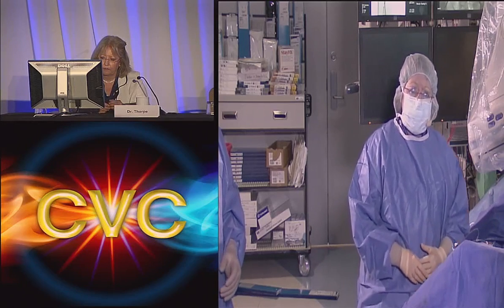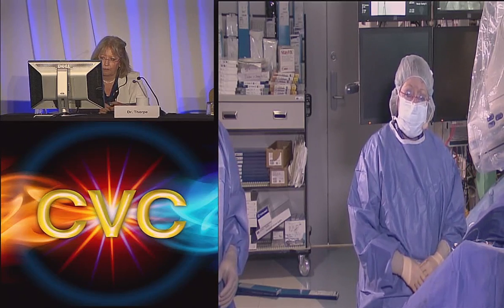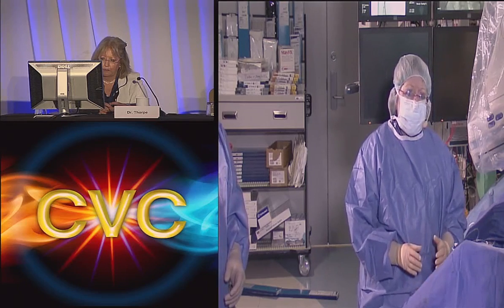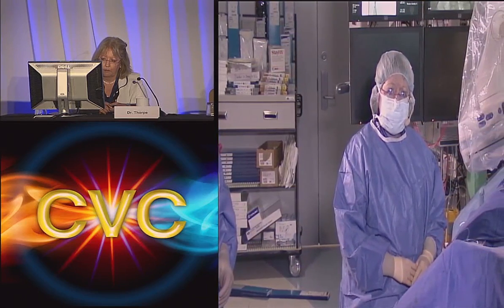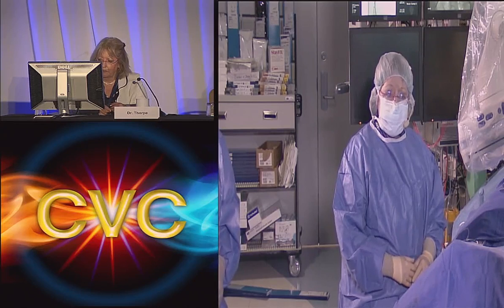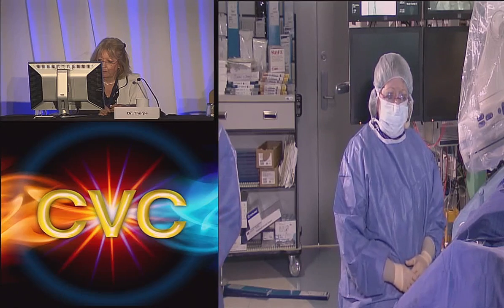So her prodrome is also that she has a heavy left leg, she fatigues, it gets tight, and it's larger by 3 centimeters in the thigh and 1 centimeter in the calf and ankle. So all that put together sounds like a story for a May-Thurner compression that's never been diagnosed and has been giving this lady venous hypertension for years with a couple of episodes of DVT. So we brought her in here today for an evaluation, and we'd like to show you the first venogram.